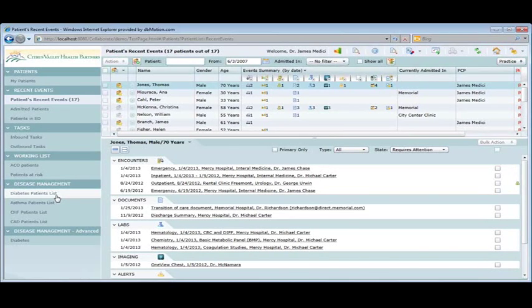Next version that's coming out is allowing two things: the end user to create their own custom lists. So if I'm, for instance, a pediatric rheumatologist and I want to follow my patients with juvenile rheumatoid arthritis, I can drag and drop patients to that list. And the next version after that is to be able to have the end user actually manipulate the inclusion-exclusion criteria.